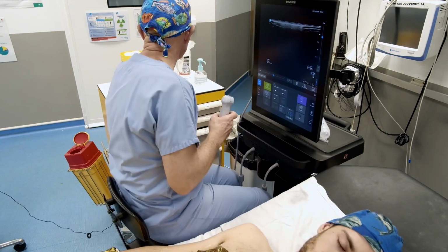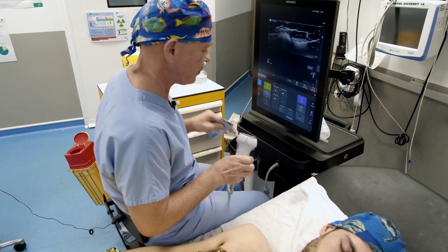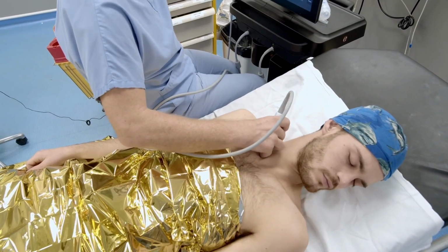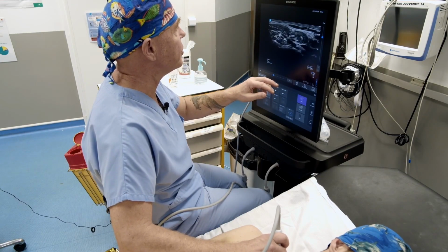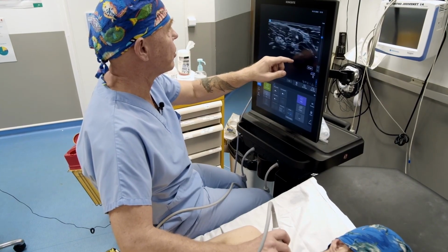For the interscalene block, it's the same. It's quite simple. You start from the clavicle. So you place your probe against the clavicle and move upwards. Okay? All right, well here we're live, you see there it is. So we use the landmarks that we saw right at the beginning.